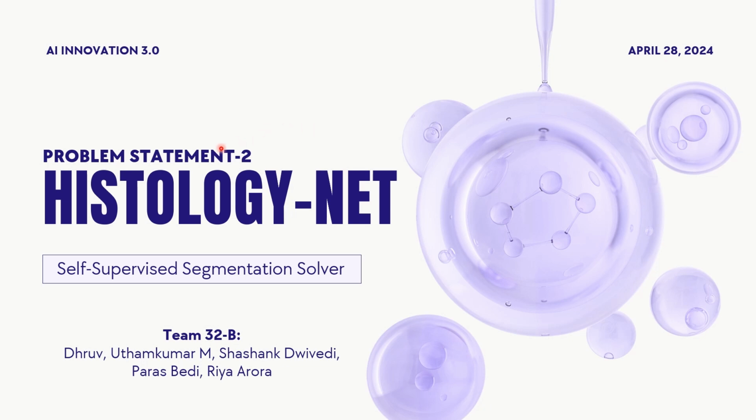Hello everyone, I am Dhruv and today I'll be presenting our solution in the AI Innovation Hackathon done by Yamaha. In this hackathon, we used a self-supervised segmenter to solve the current problem.